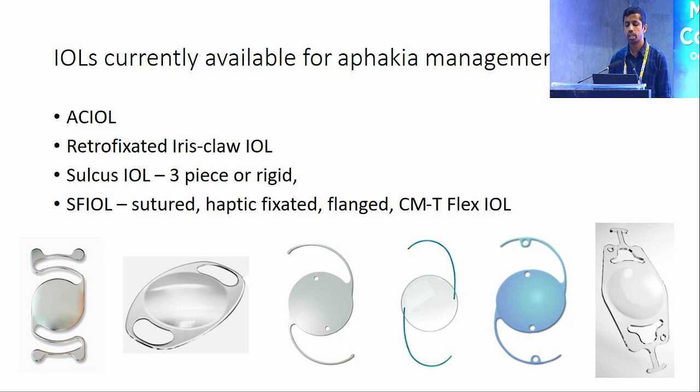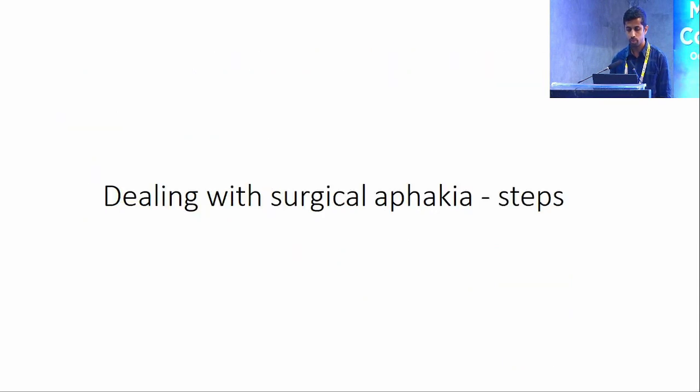So the IOLs currently available for aphakia management include AC IOL, retrofixated iris claw IOL, and sulcus IOL. We have either a 3-piece or a rigid IOL, and SFIOL can be of various techniques: sutured IOL, haptic fixated IOL, the flanged IOLs, or the newer one, the CMT flex IOL. So we'll see how to deal with this surgical aphakia.